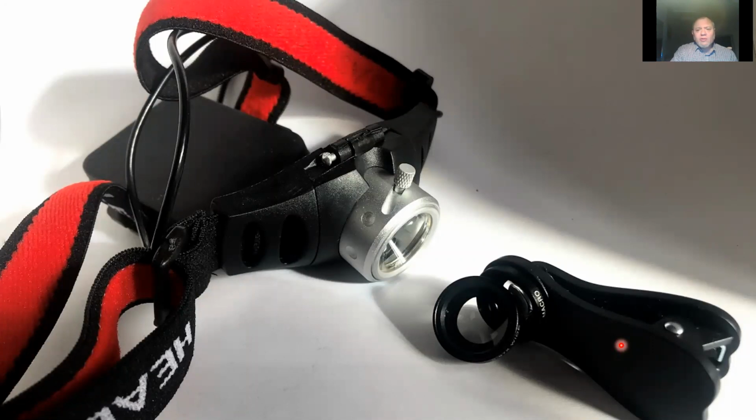So some sort of light source in addition to the on-camera light is important. So I prefer, this is my favorite tool, this is an LED Lenser head torch. It's got a focusable beam, and also it's got a rheostat and a very small headpiece, so I can hold that in the palm of my hand whilst holding the camera in the other.